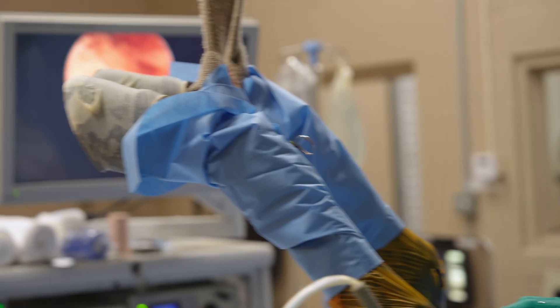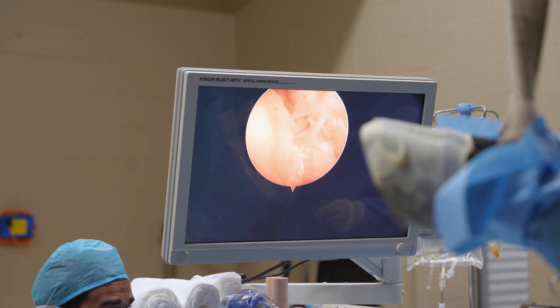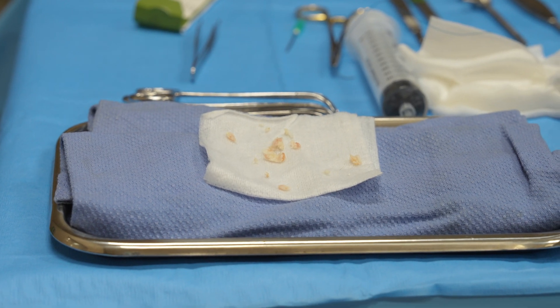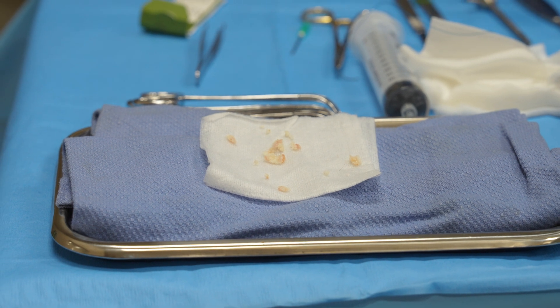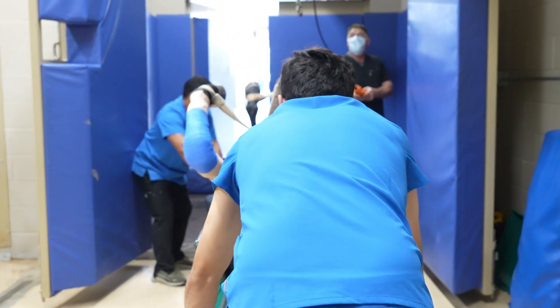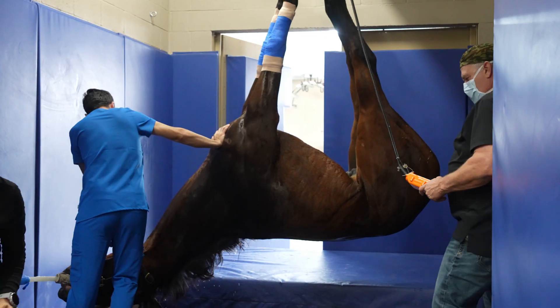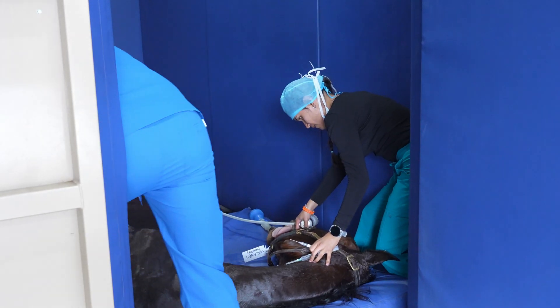Triangulation — because if you think about it, it looks like a triangle. We identify the fragment that we already saw with the radiograph, and we take it out. The horse recovers, and 60 days later starts doing some exercise. At 90 days we might do regenerative therapy like PRP or amnion — like all the ones you've learned from my ebook on equine regenerative medicine — and then the horse goes back to work.